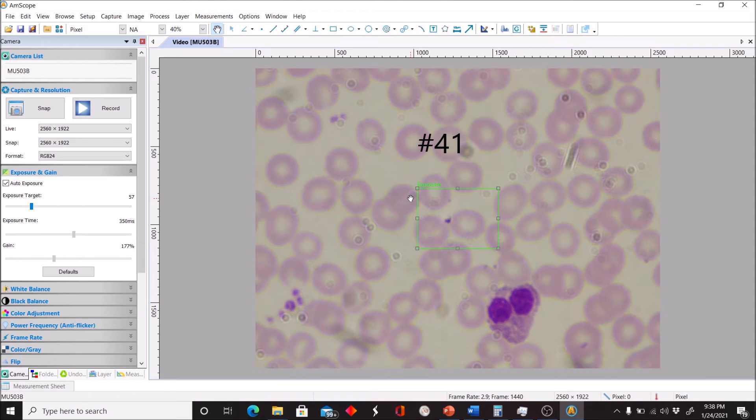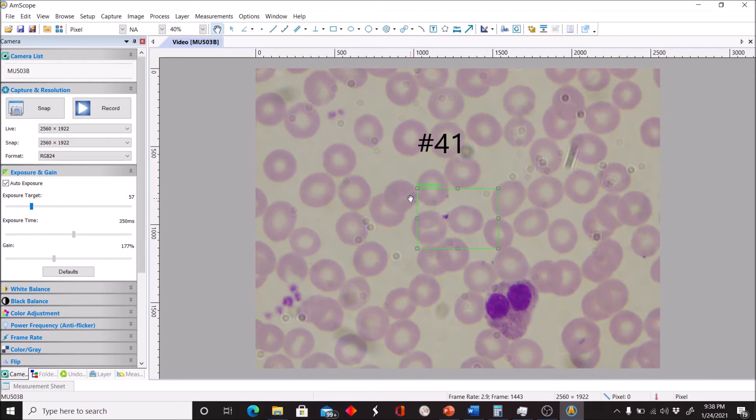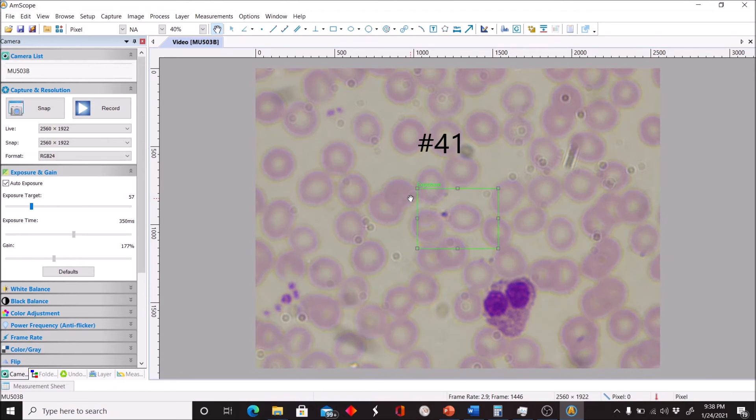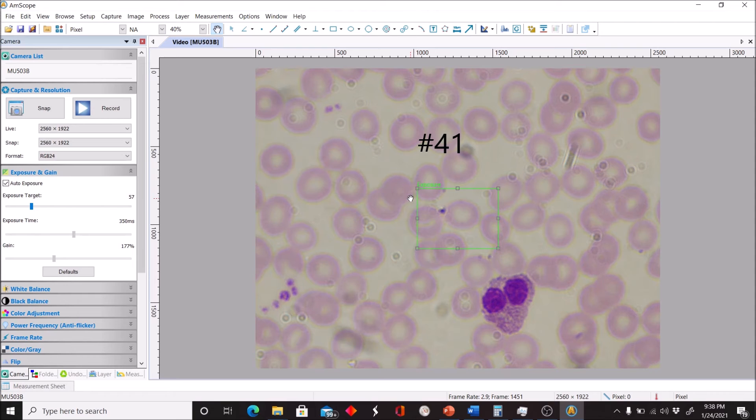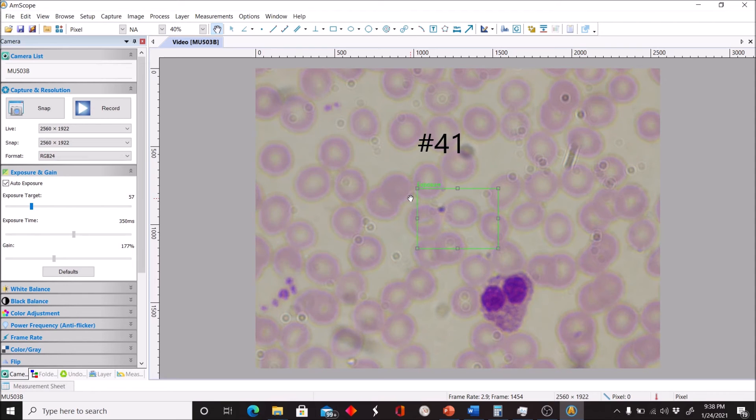This is one of our more uncommon granular leukocytes, so identify that one as best as you can.